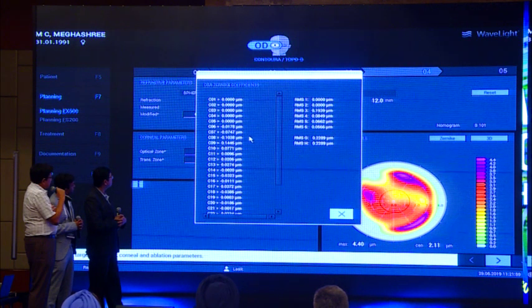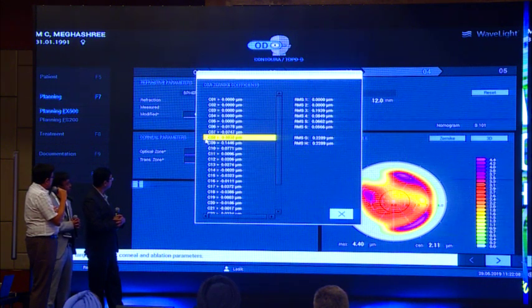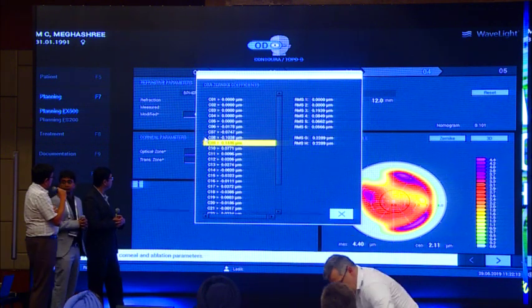So C4 is 0, C12, C7 is a little on the higher side. But C8 is on the more higher side. C8 and C9 both are higher. So it's more of coma related. Yeah, so what you are saying is right.